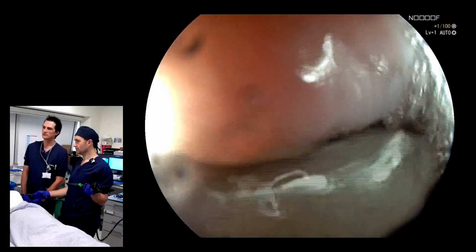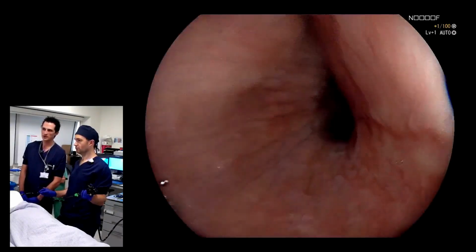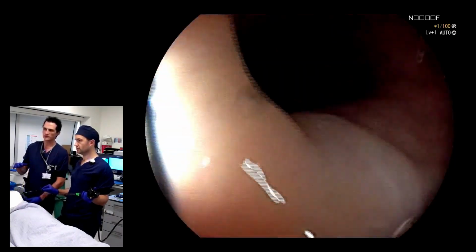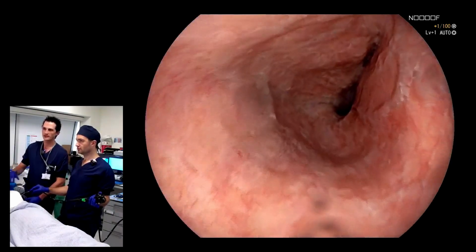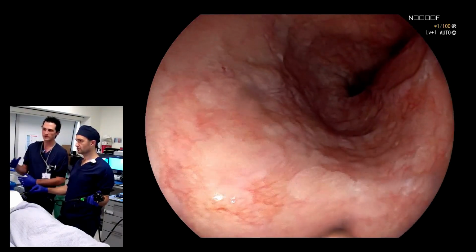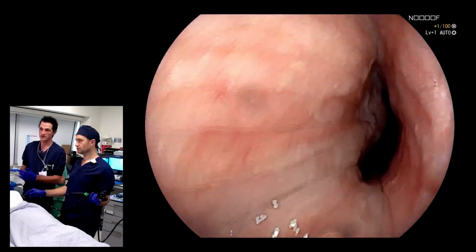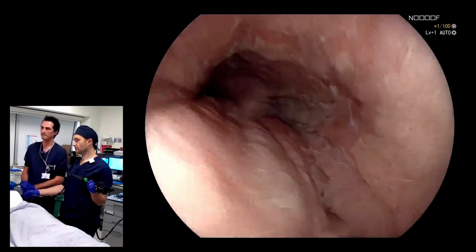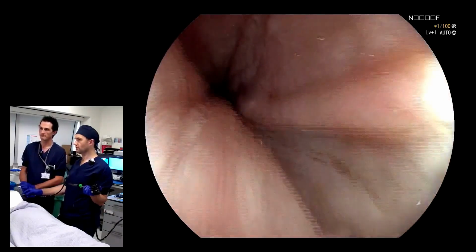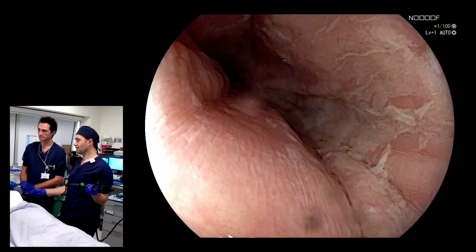You see at the proximal esophagus the normal squamous epithelium, which looks a bit paler but quite smooth. But once you go down more, you have a sort of wobbly appearance, where you have some thicker plaques and some thinner parts. It's like it's chronically inflamed. It's like skin that's been in a bath too long, and I think it's a good analogy because this is also squamous mucosa, just like the skin, and it looks like the surface is peeling. You have that exudative attachment.